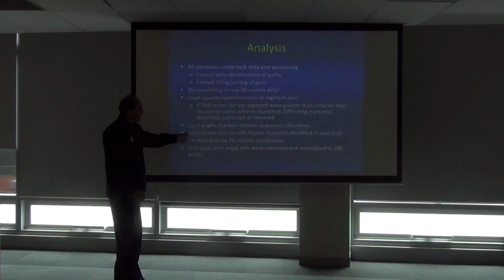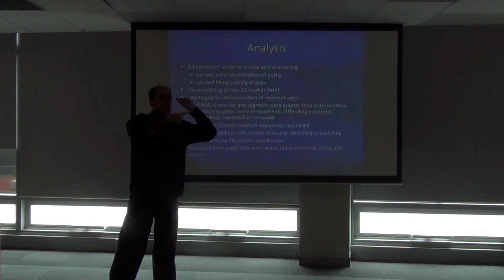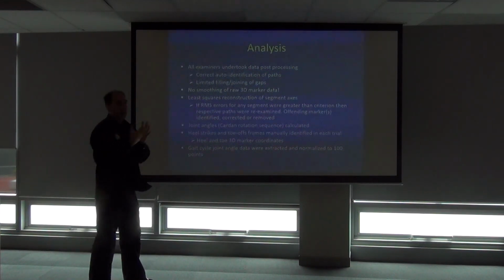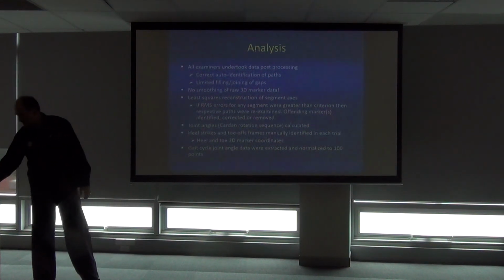That's a mission. Okay, using X, Y, the heel toe coordinates, go through every trial, heel strike toe off, and then gait cycles extracted and all normalised to 100 frames. So that's the analysis procedure.